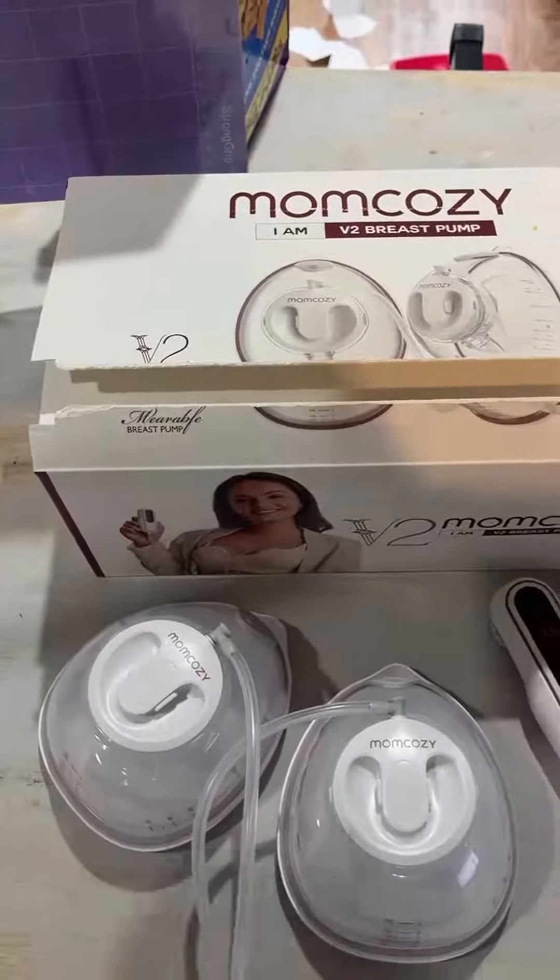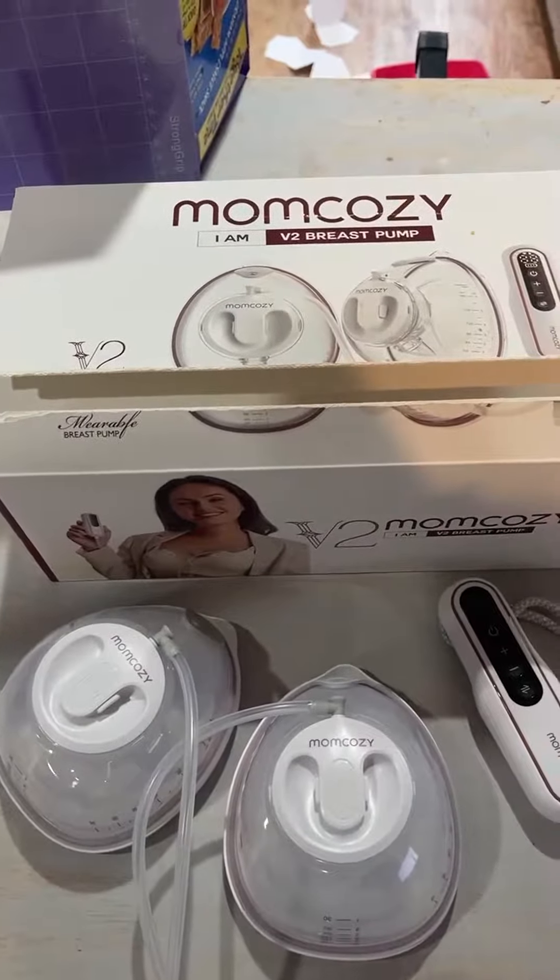This is the Mom Cozy Breast Pump. This is actually a new arrival — it's the V2 Breast Pump.